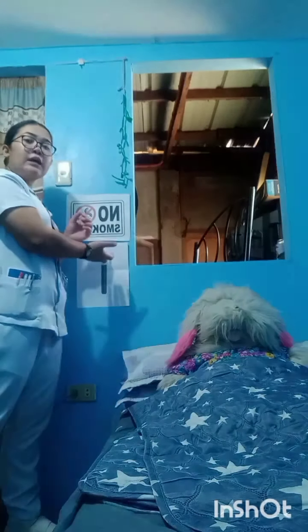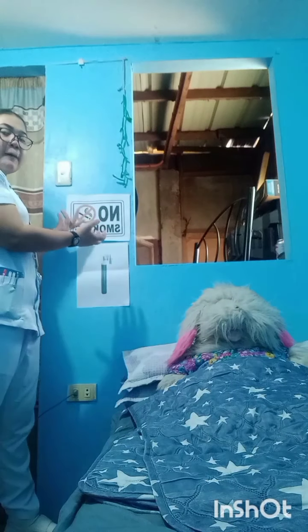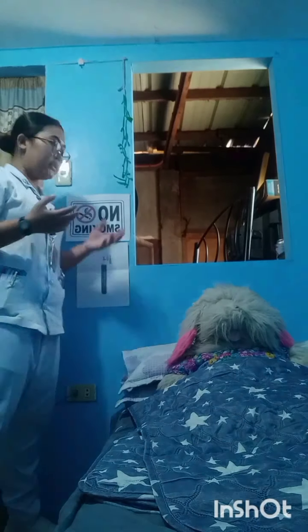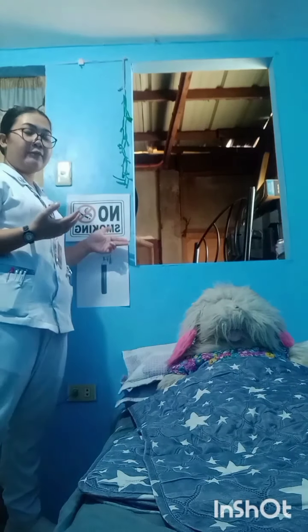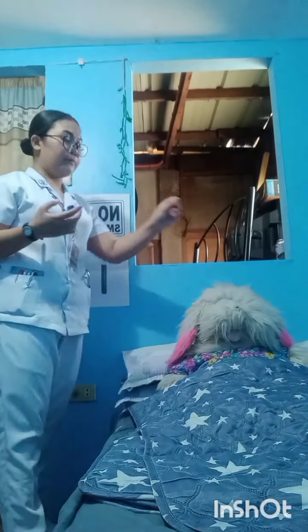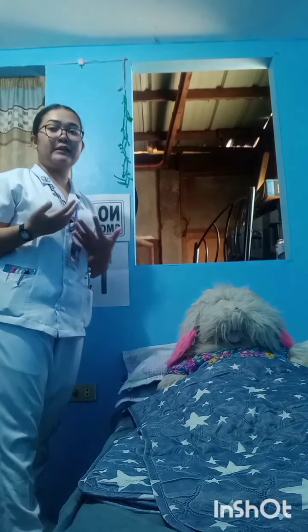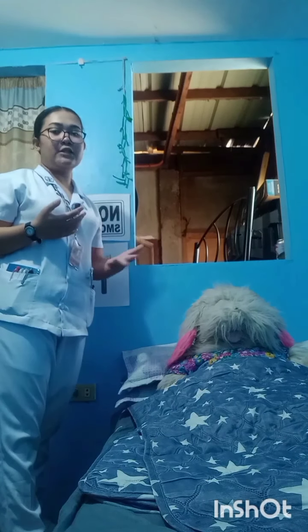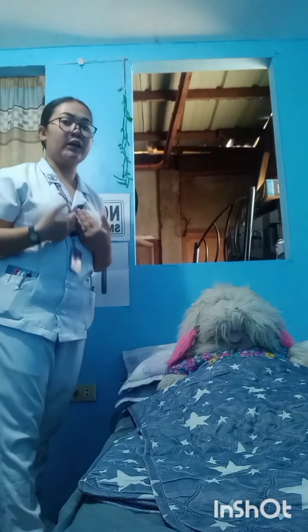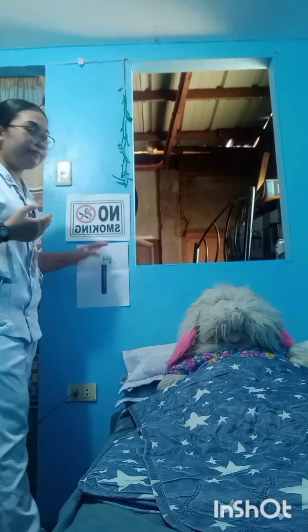Ang purpose ng humidifier bottle, alam naman natin na ang oxygen is mainit. So, yung oxygen, mag-pass through dun sa humidifier bottle, magko-cool down yung oxygen, para pagbigay natin ng oxygen sa ating patient, hindi na siya mainit. Kaya may mga patient na sabihin na oxygen is mainit, nakaka-burn ng lungs. Hindi, kung may humidifier bottle.